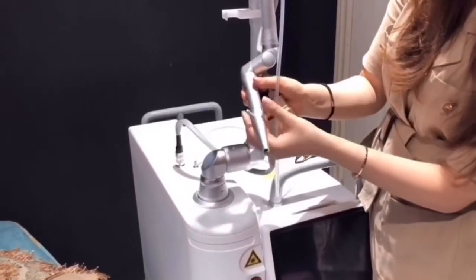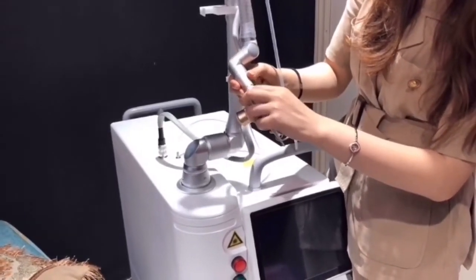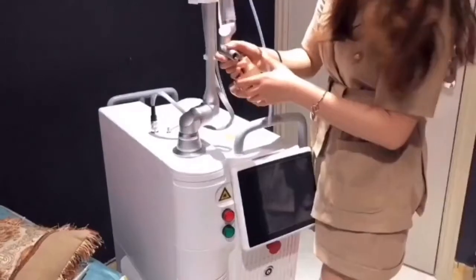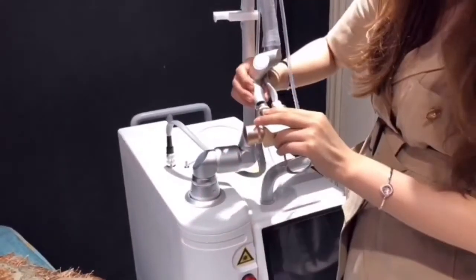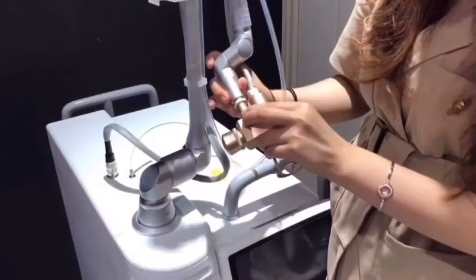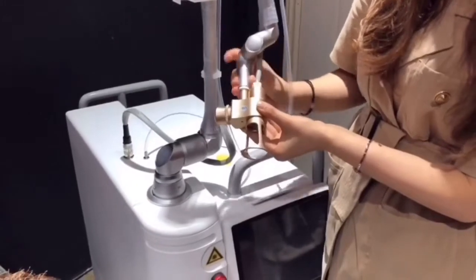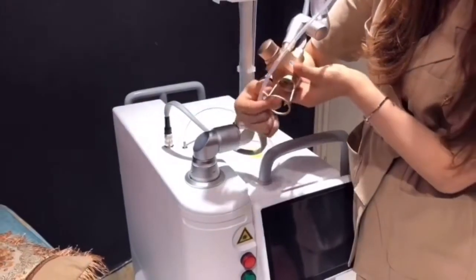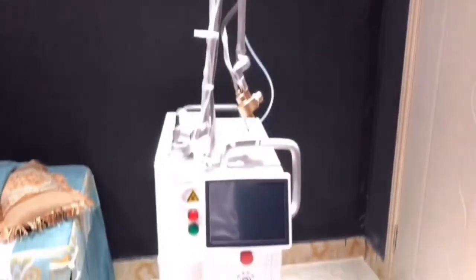Take off the cutting head. Connect the fractional head. Then connect the plastic pipe to the head.